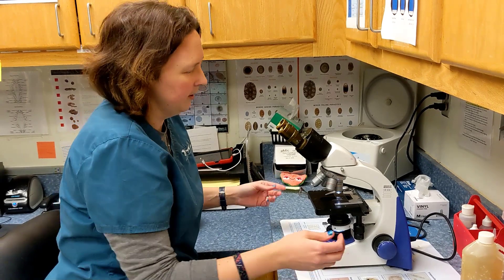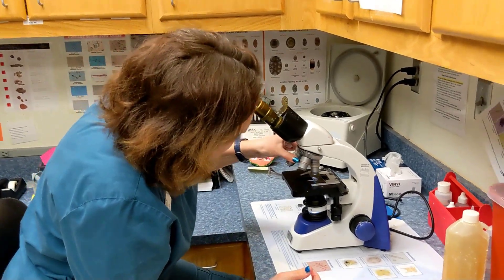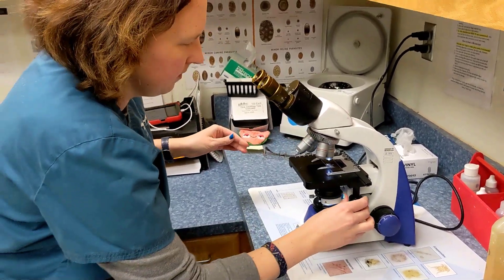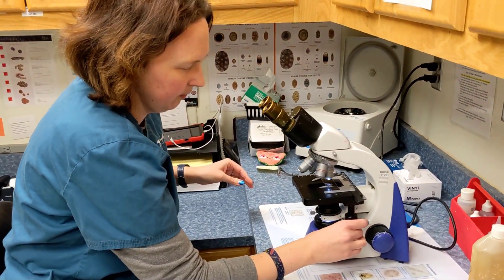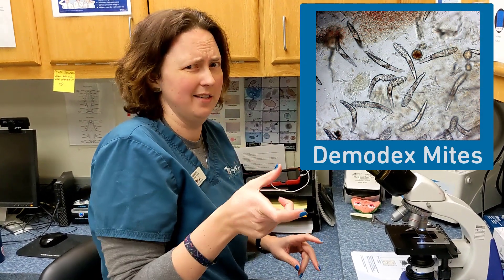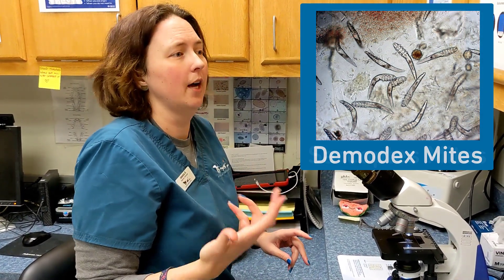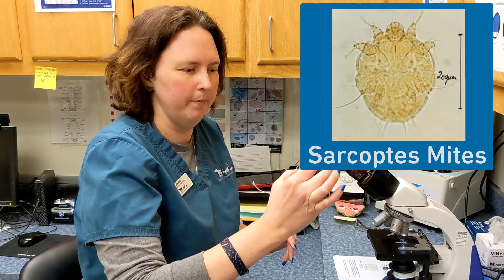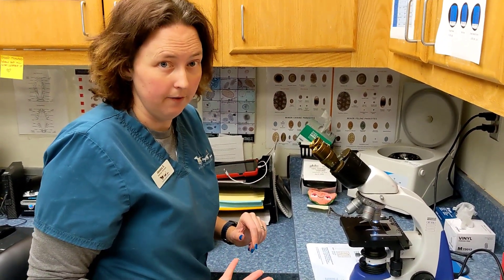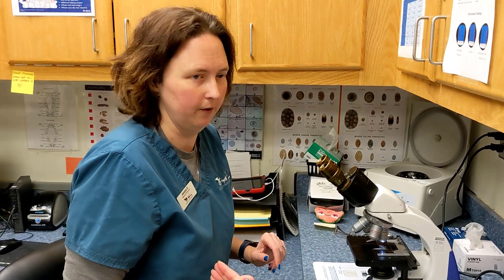Once we're all set up on our microscope, we're going to want our lens at 10 power. That's all the higher power you need to be able to see the ectoparasites that we're looking for. If you're looking for Demodex mites, which look kind of like a cigar with legs, or Sarcoptes mange mites, which are a big circle with legs — Demodex is relatively easy to find, Sarcoptes is much more difficult.